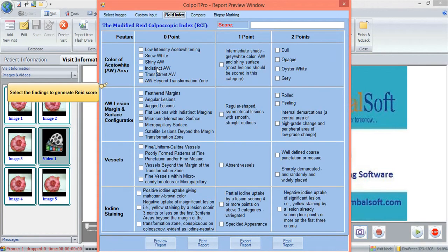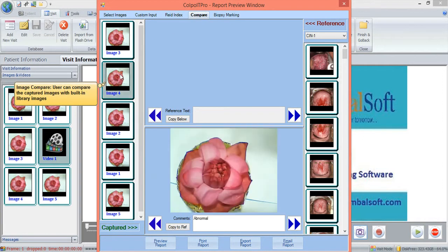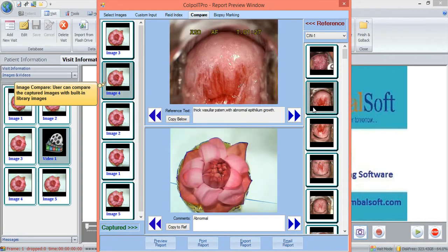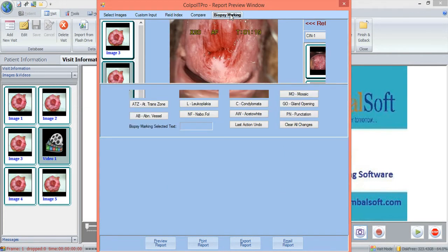Reid index creates a score based on the choices made by the user from the library of findings in the application. Compare will compare the captured images with the existing library of images and assist the user to make conclusions based on the findings. Biopsy marking helps the user to make markings on the biopsy graph using an inbuilt library of inferences present in the application.